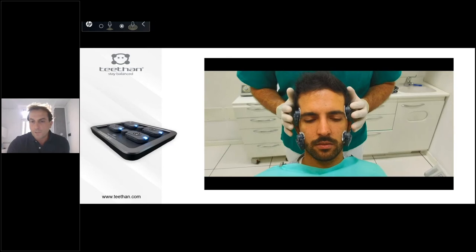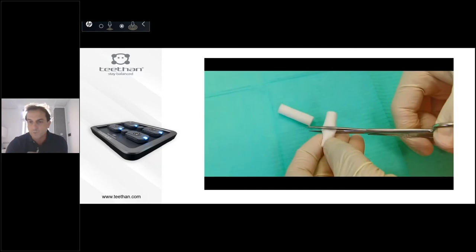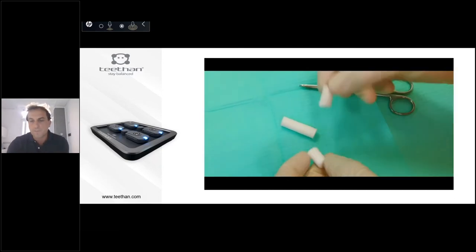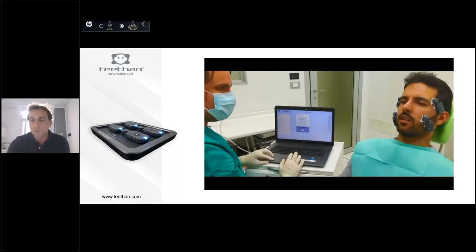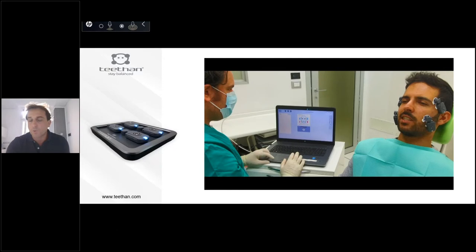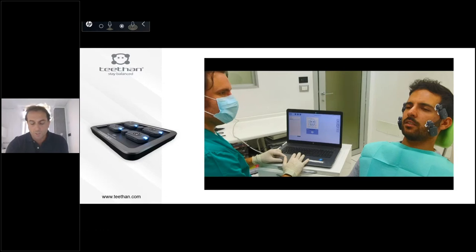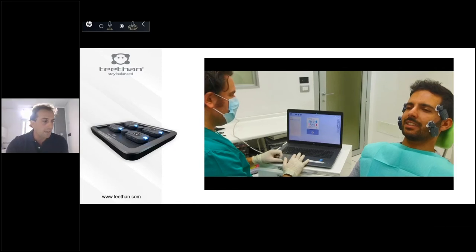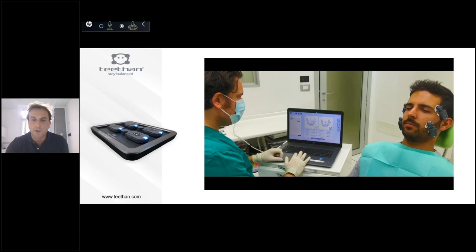And as you can see on the screen, if you have a long beard, it's not easy to use this instrument, but you can use it in this situation, no problem for this patient. And you can use it in the same position, and you can use it during your first visit or during your therapy. Today, I would like to share with you two clinical cases. The first case is a fixed prosthodontic case. The second is an overdenture. And I want to show you everything about the digital workflow with this device.